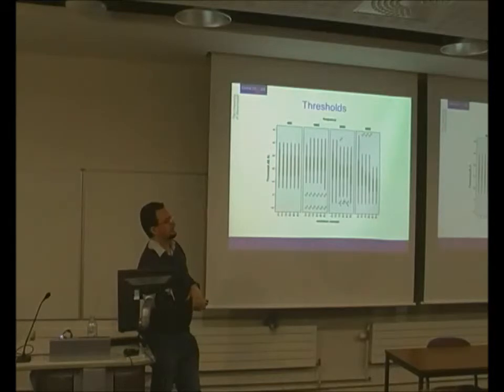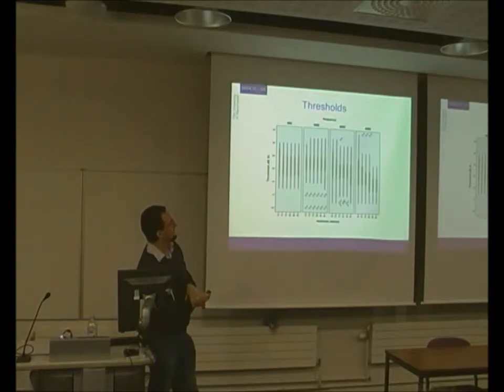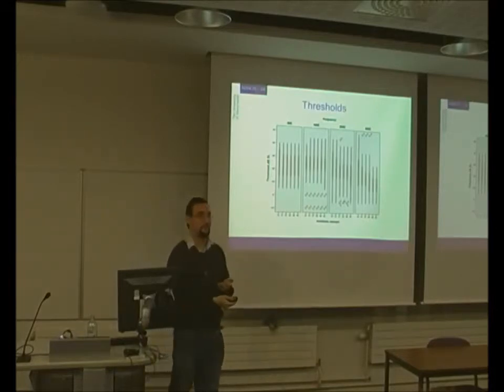So let's have a look at what happened to the thresholds then with recording time. Each of these boxes represents a frequency, and this is all of the data from the 2 sessions from all of the subjects. And we can see there's a downward trend of threshold across recording time, allowing only 15 sweeps, and then 21, 27, and so forth until we get to 45. As we get to 45 sweeps, we get a downward trend of getting closer to the threshold, which is what we'd expect, because there's less noise.